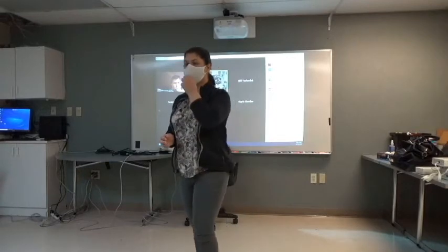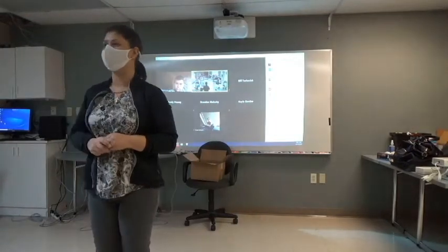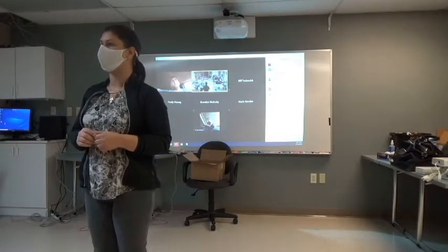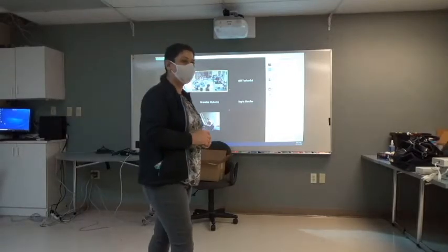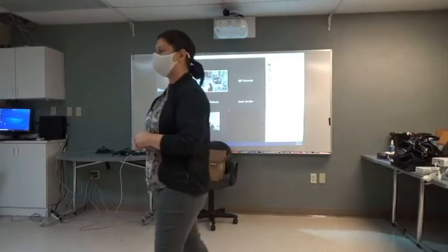All right, so if we take a peek all the way up at the top, you guys are going to see where your four lead connects to. And if you follow that out to where the colored wires separate, that's where your 12 lead is going to get hooked into. Your four lead, 12 lead, those go on the same way you've always been used to putting them on. There's nothing different about that.